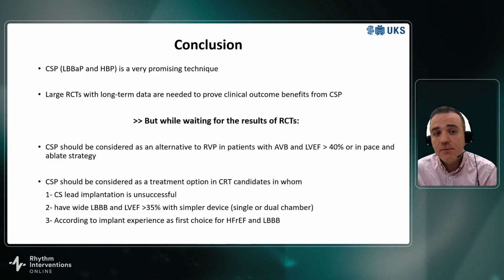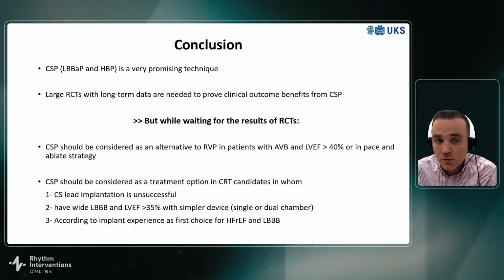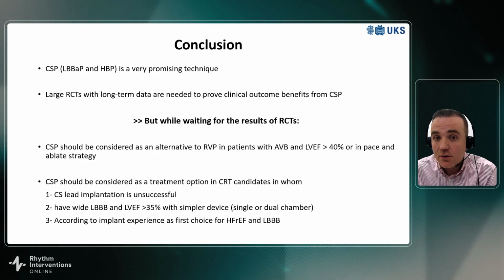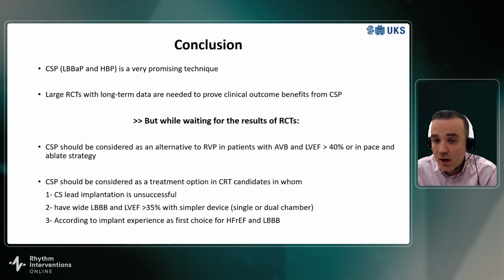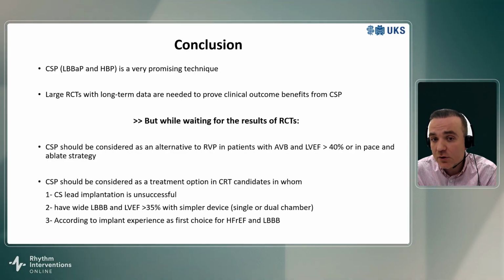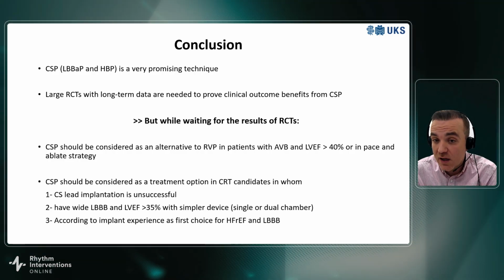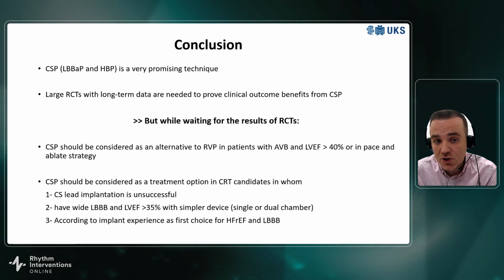So to conclude, CSP is a very promising technique, and large randomized control trials are needed to prove the clinical outcome. However, while waiting for the result of large randomized control trials, CSP should be considered as an alternative to right ventricular pacing in patients with AV block and LV function above 40% or in pace and ablate strategy.